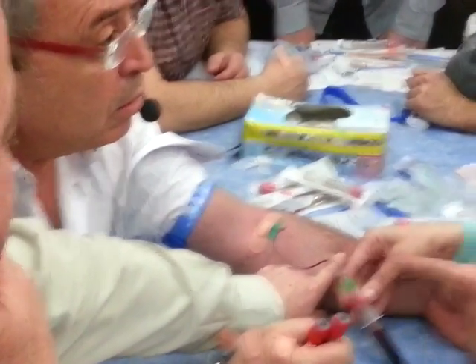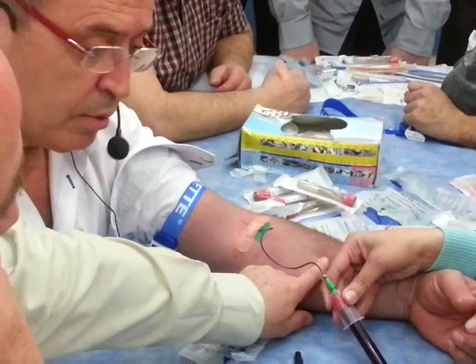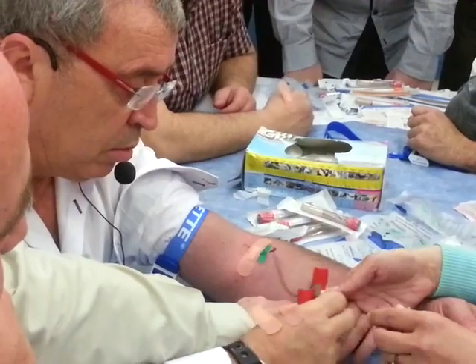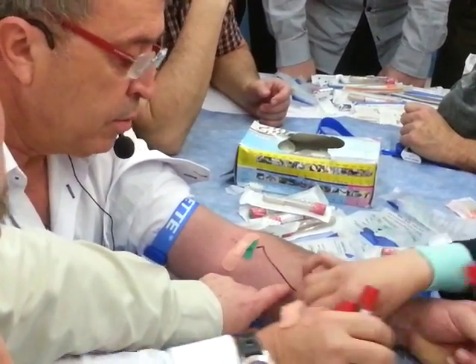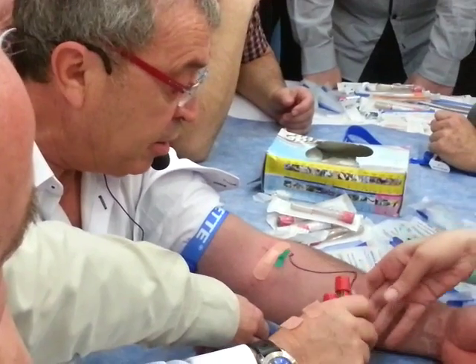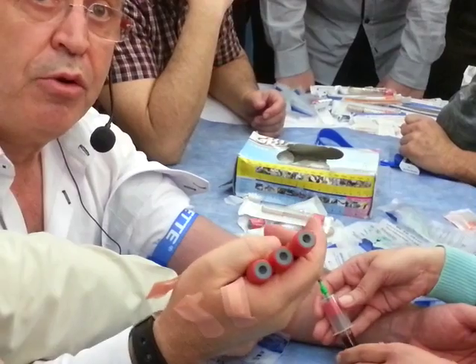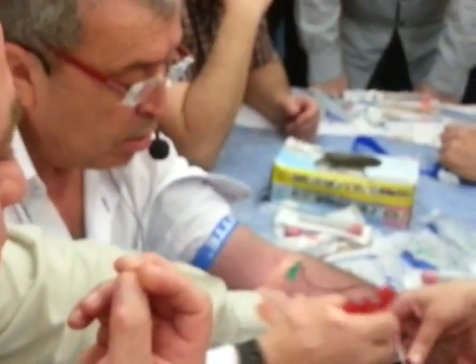If I want for extraction, I have to take it to you? Just for extraction. Another one? Take care, because if you pull too much... Now, we can put the tubes in the machine, but we have to balance these tubes.